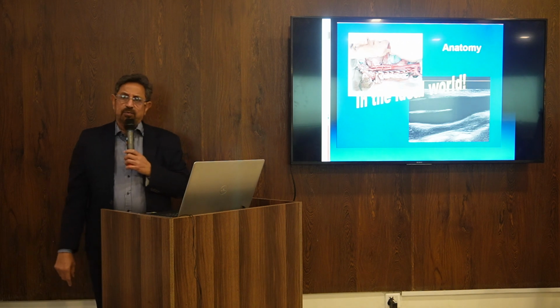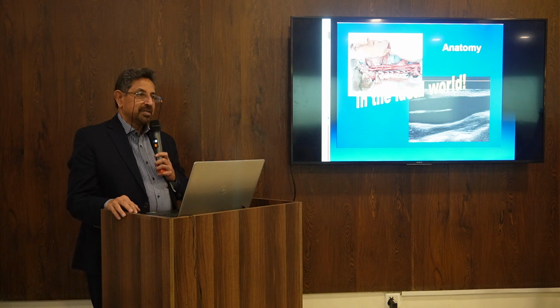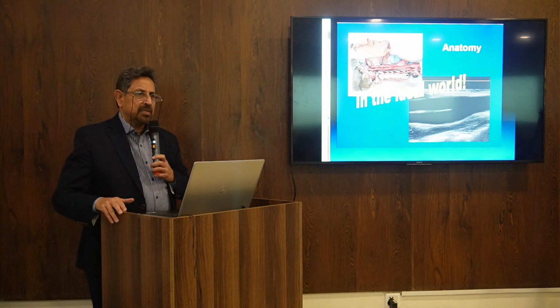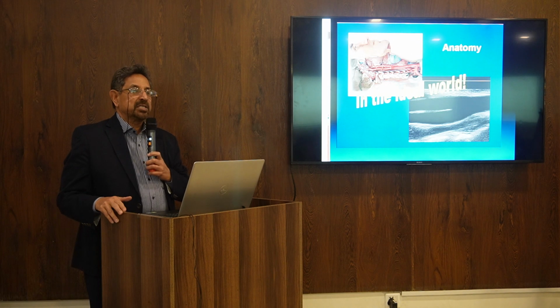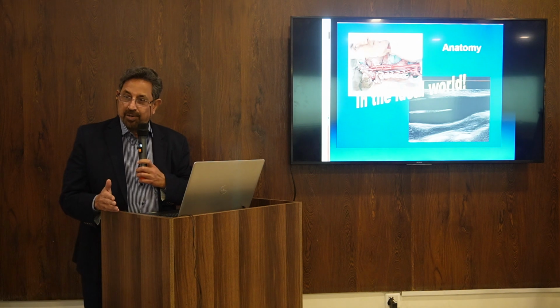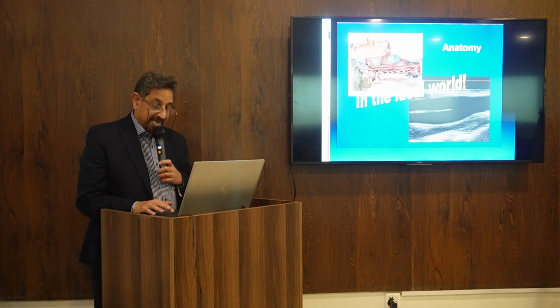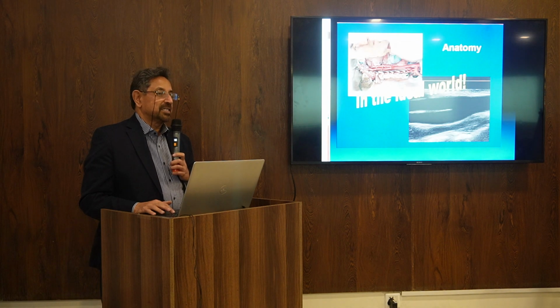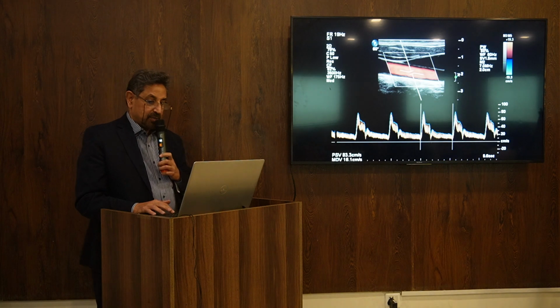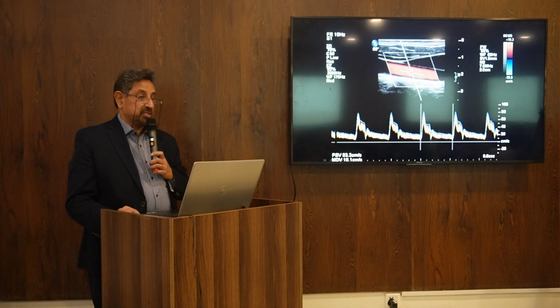In an ideal world, when the wall is smooth with no calcium plaques, but does a patient come with a smooth wall? No. When patients come for peripheral vascular disease, they are old people having some problem. If you are living in an ideal world, we won't get those classical cases. Normal people won't come to the doctor for peripheral vascular studies. So in an ideal world you get this crisp, very good picture, right?